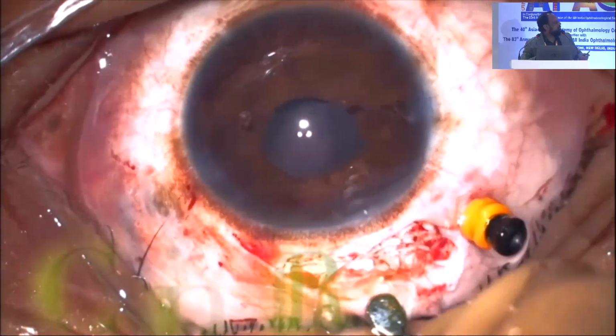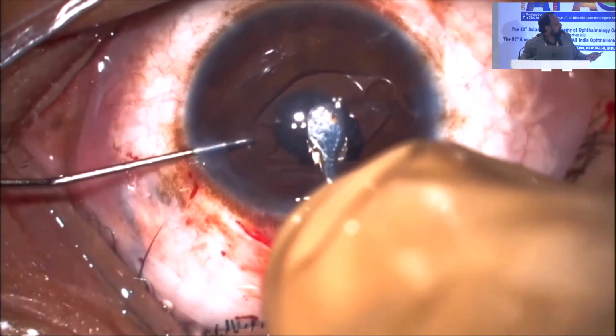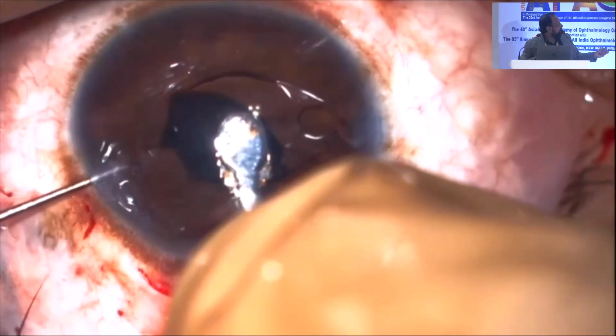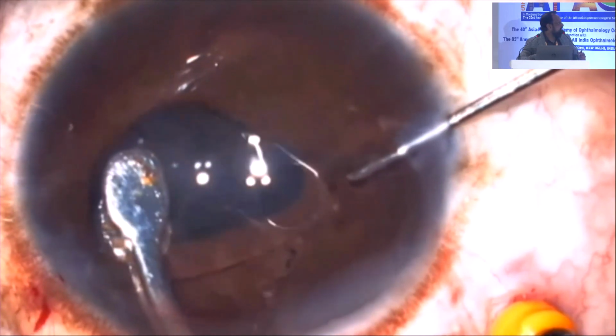Why? Because sometimes if we go anterior, that is when you get this cat-eye kind of pupil, and if you go too posterior, you can damage the roots and cause bleeding. So again, I'll show you in slow motion in this video. Making sure of the firm grip, my second instrument is already inside, and then take it to where you want to clip. Yes, and that movement of one hand going up and the other hand going down.